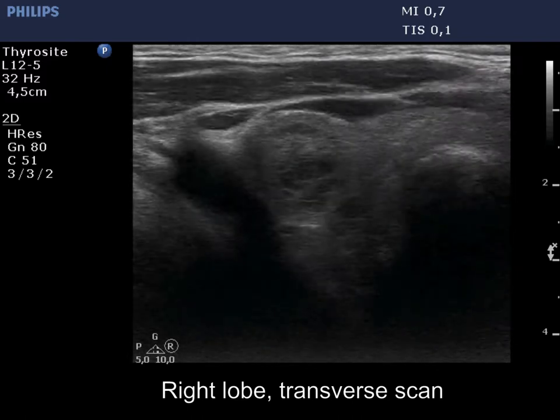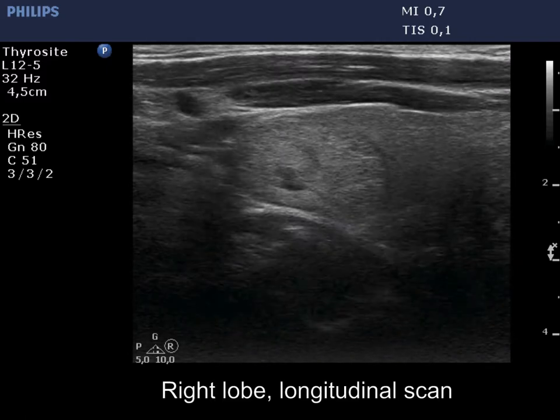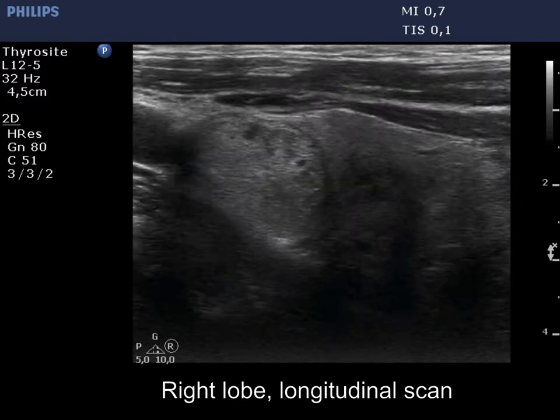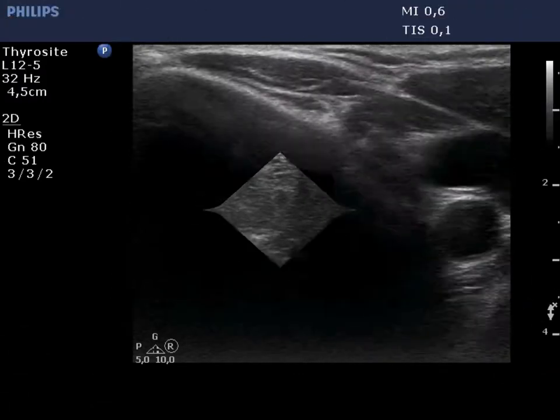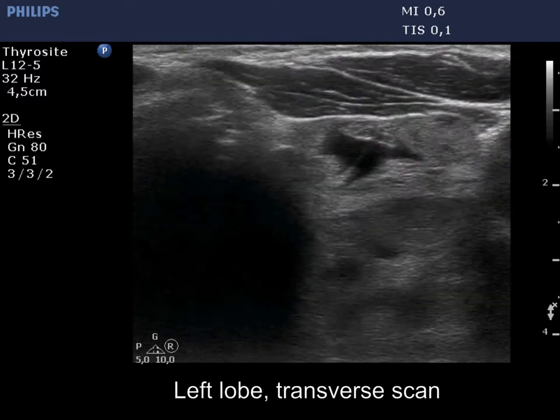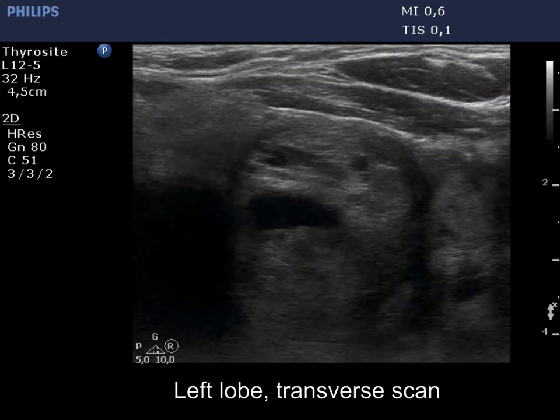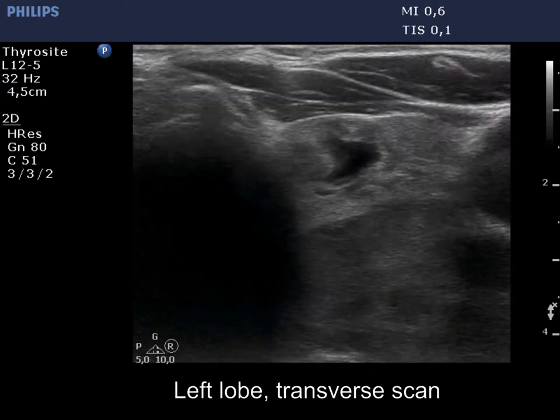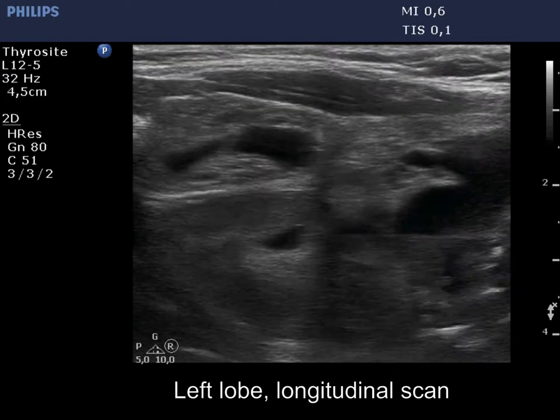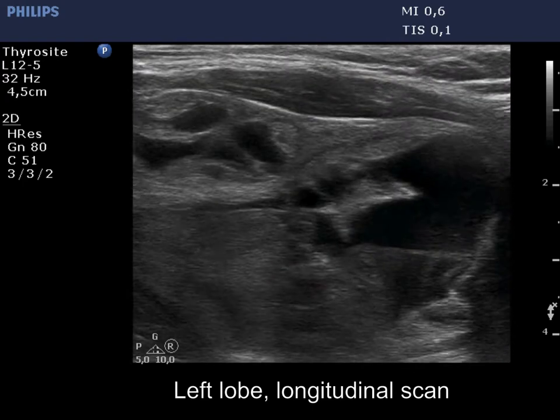The right lobe is echinormal and has several nodules with different echogenicities. The lobe is not enlarged. The left lobe is enlarged and is composed of multiple nodules. The lowest is remarkable because of the presence of echogenic figures.